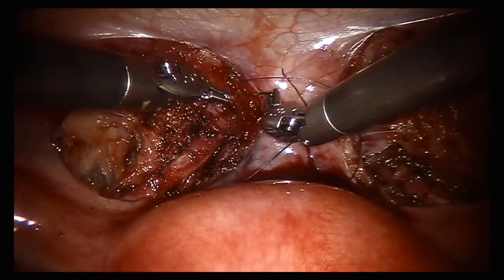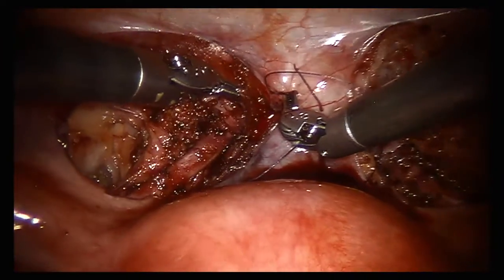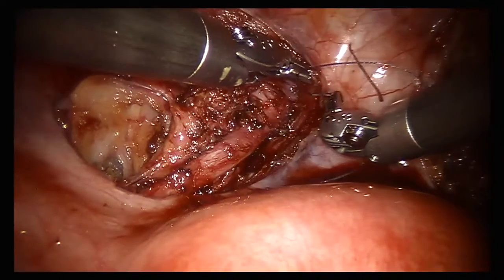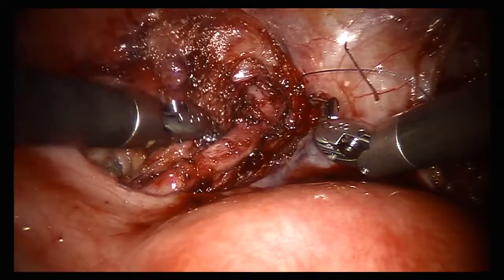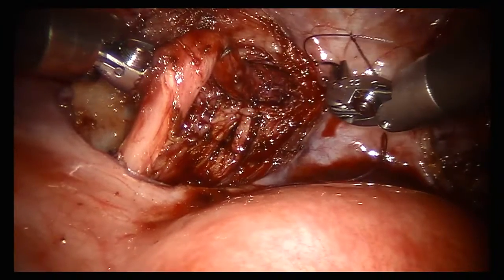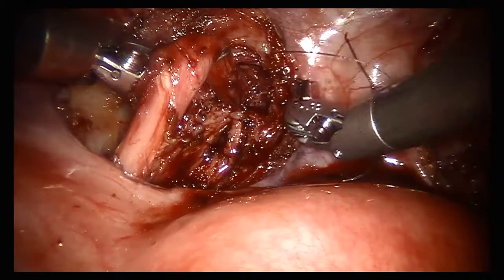The initial dissection is not impeded by the port placement. The deep pelvic portion of the ureteral re-implantation is essentially identical to a traditional approach. Note that excellent freedom of movement of the instruments is retained with the HYDES port configuration.